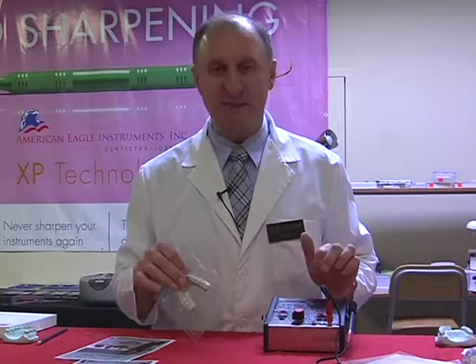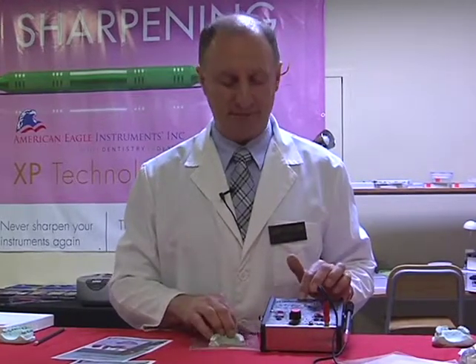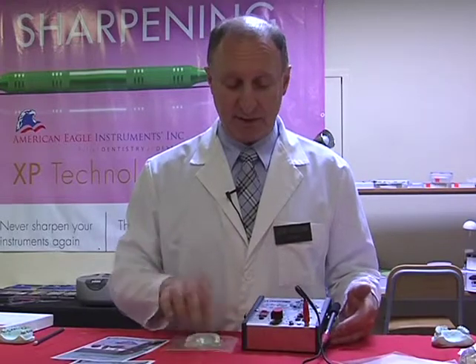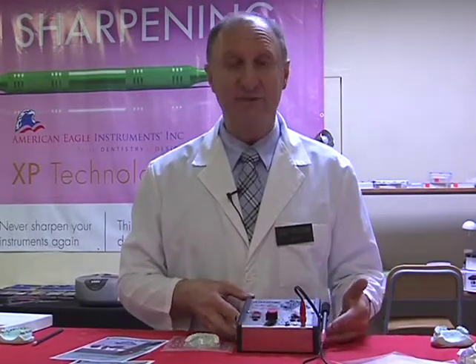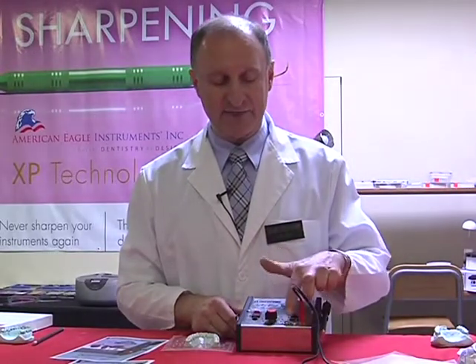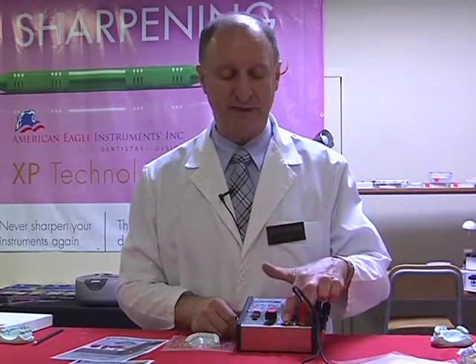In that case, I'm using an instrument called the razor tip. Now this is an item that's made in Canada, Saskatchewan. The company has 2 different styles of units. I'm using this dual unit, which has a facility to hold another tip in the case.